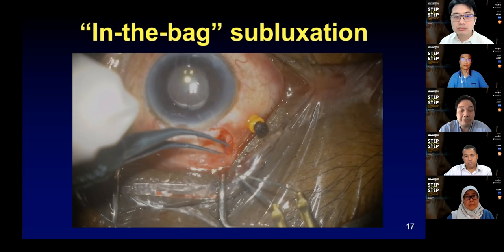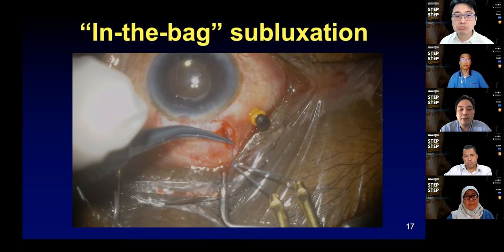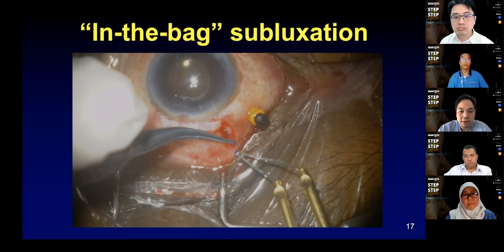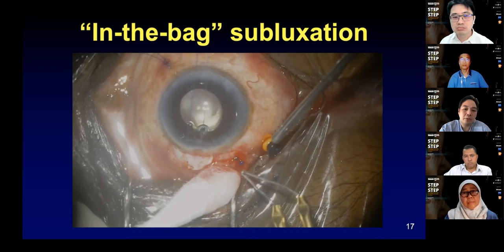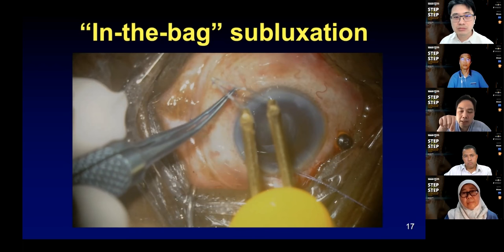What we need to do now, and this is my first case, in fact, is find the correct length of Prolene to create a good size bulb for this 27 gauge tunnel that you created into the sclera. This was me starting off, and I found that it got too big and I had to chop it off and start again. The optimum, to create an adequately sized bulb so that it will sit in the sclera without potential for eroding through the conjunctiva, is about 2 millimeters.